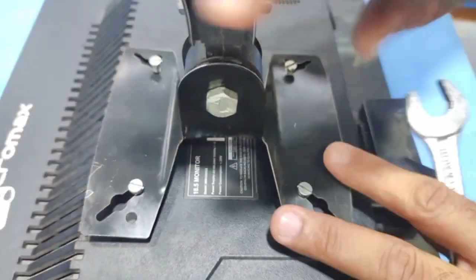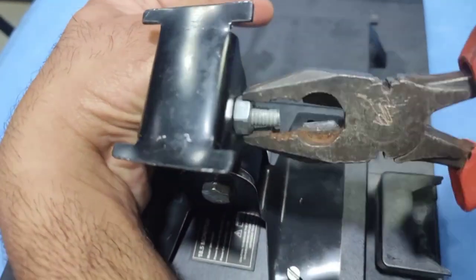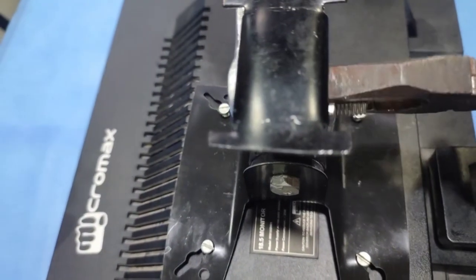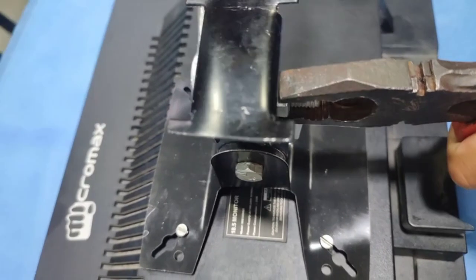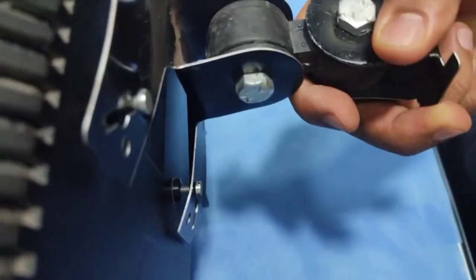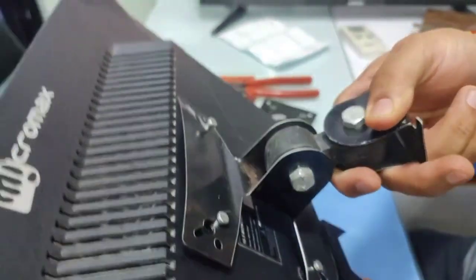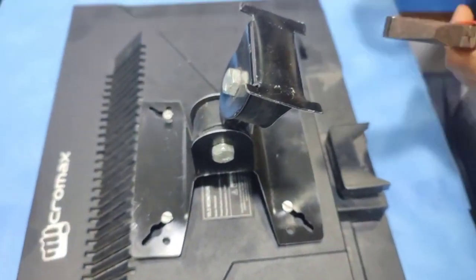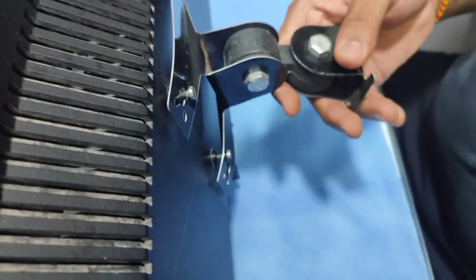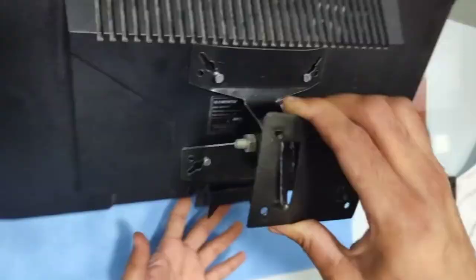Once the connection is done, we are going to set the angulations of the screen. As you can see, the screen can be adjusted right to left and up and down. First, tighten them just a little bit so they are not completely loose. We are going to initially tighten them, and then remaining settings can be done when the screen is completely connected to your dental chair. By using a plier and a wrench, I am tightening it. Once the left-right tightening is done, hold your screen with your hand and protect it from the bottom, then set the up-and-down angulation. Depending on the height you connect your LED screen, you will need to give it an angle so the patient in a supine position can observe the screen properly.